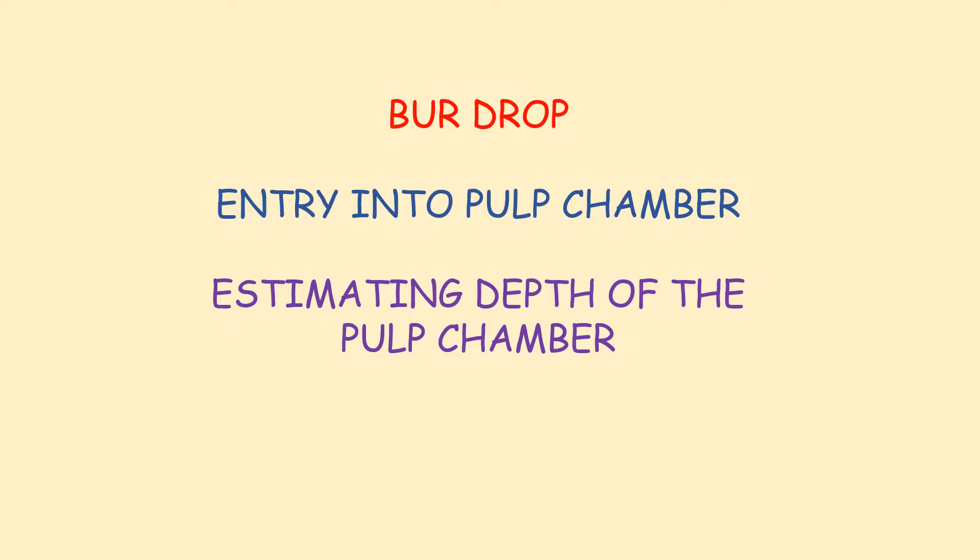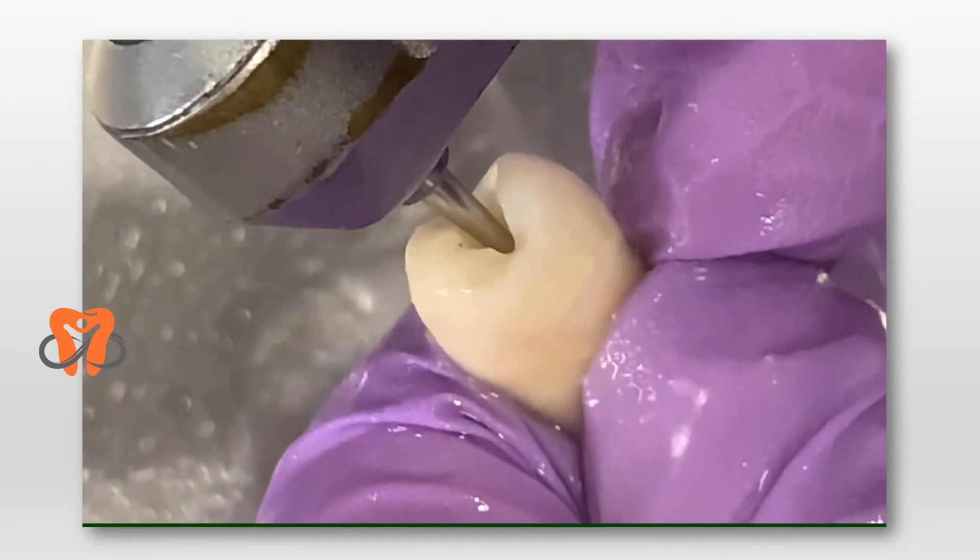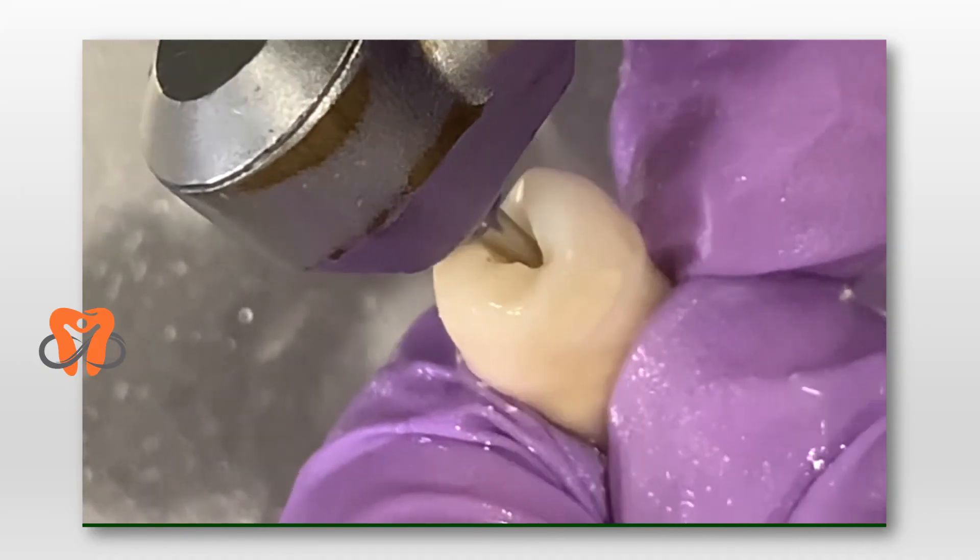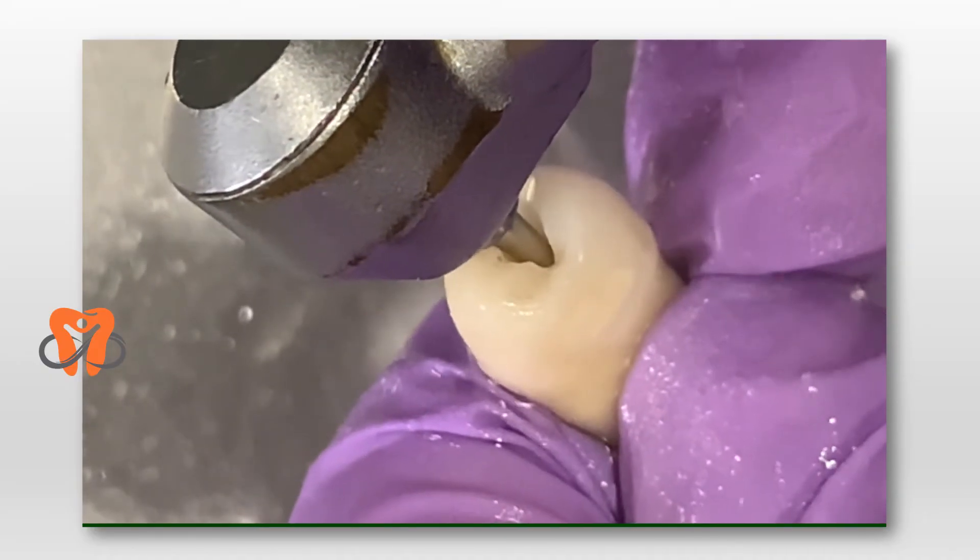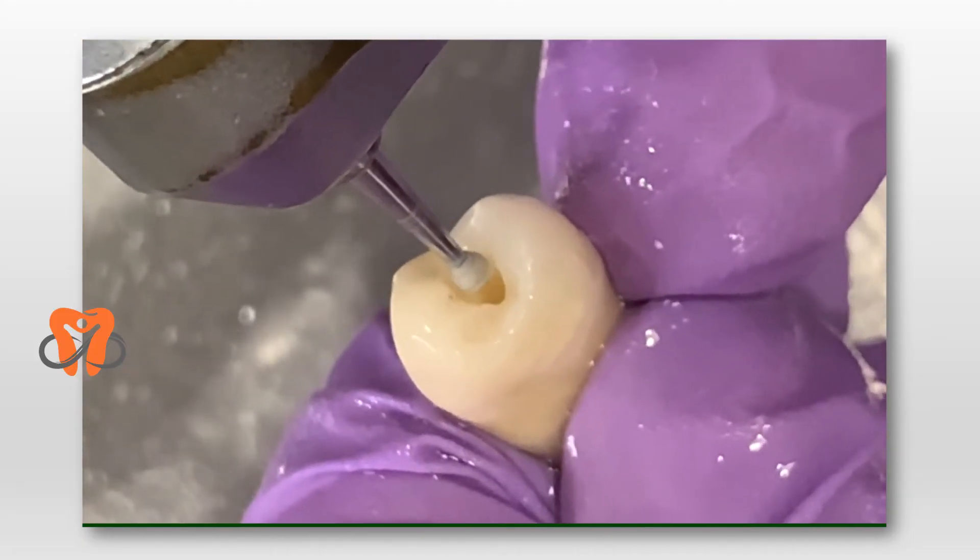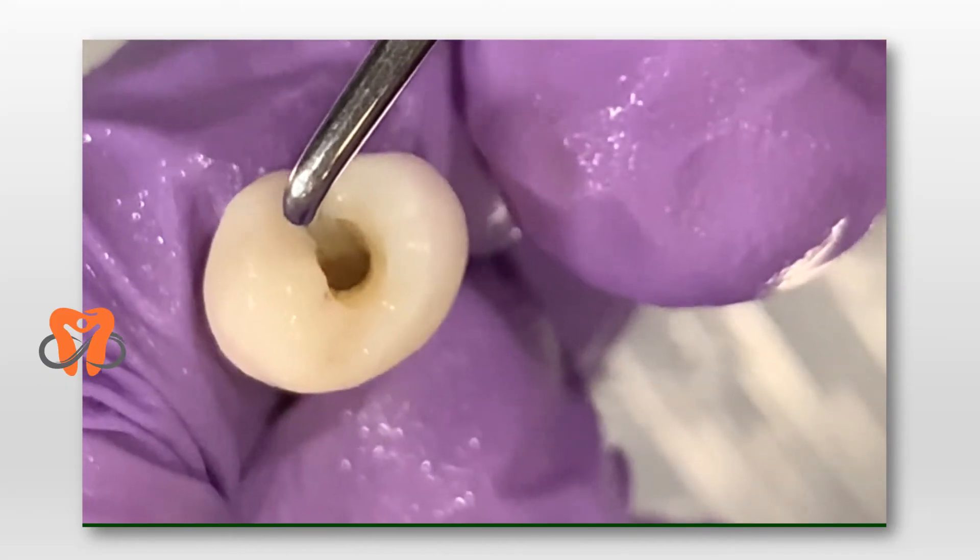In the next section, I will demonstrate the burr drop which indicates entry into the pulp chamber, and then how we estimate the depth of the pulp chamber. We cut through the dentine to reach the pulp chamber till we feel a burr drop like this, and then we stop.